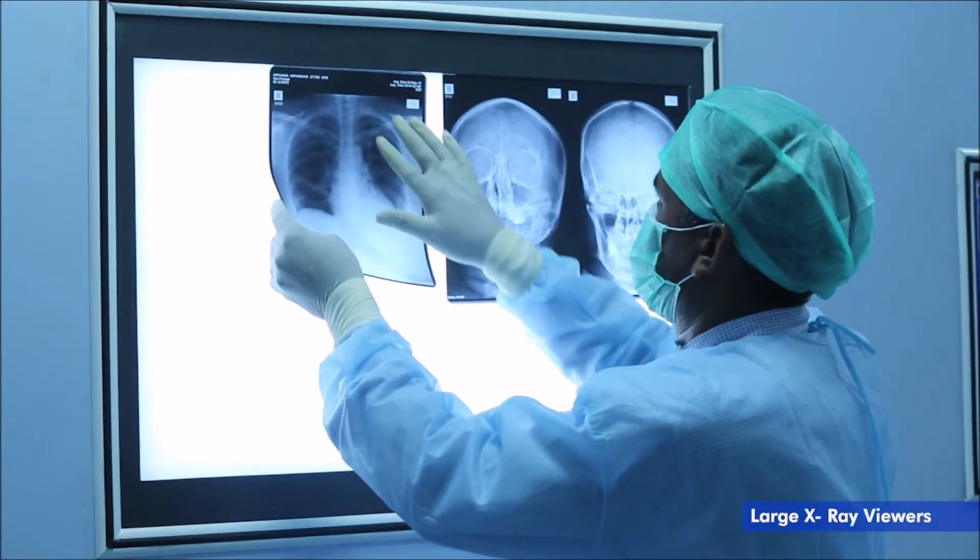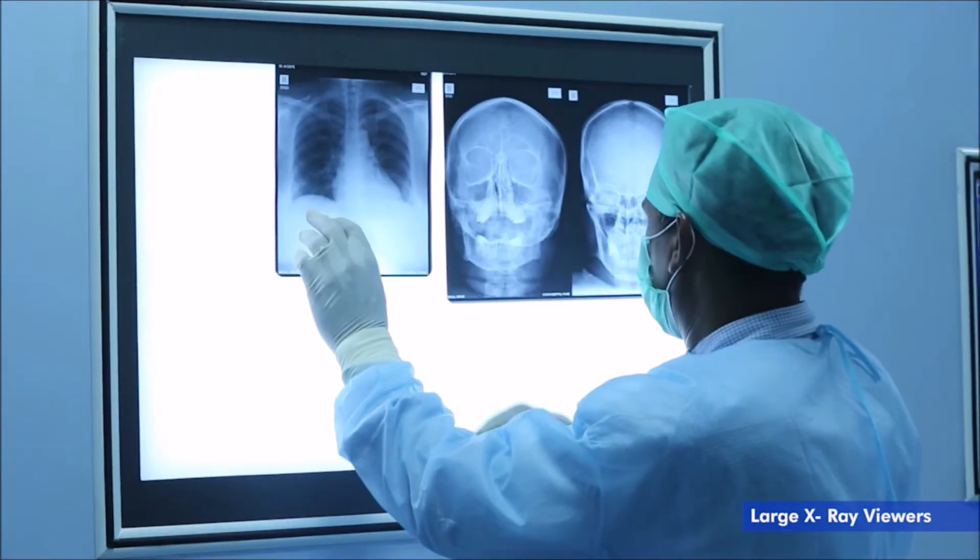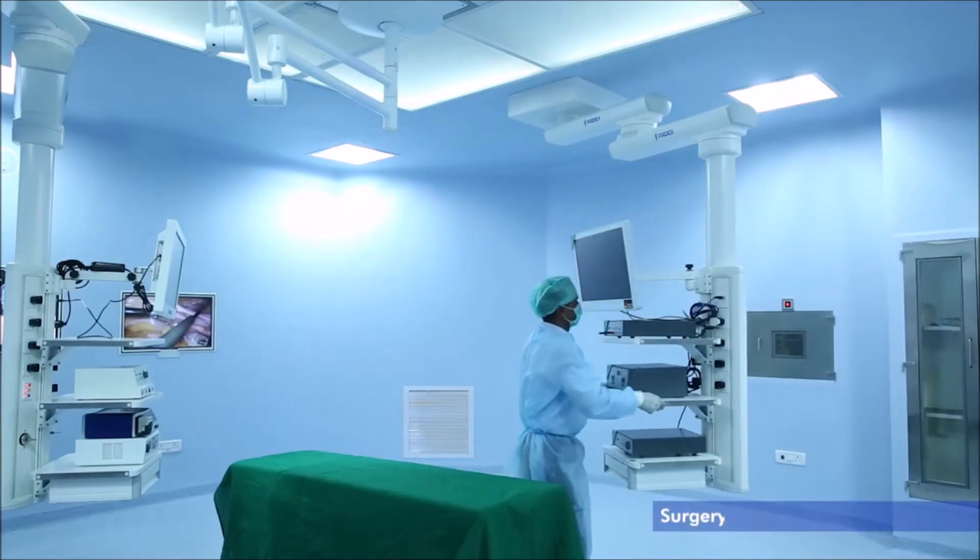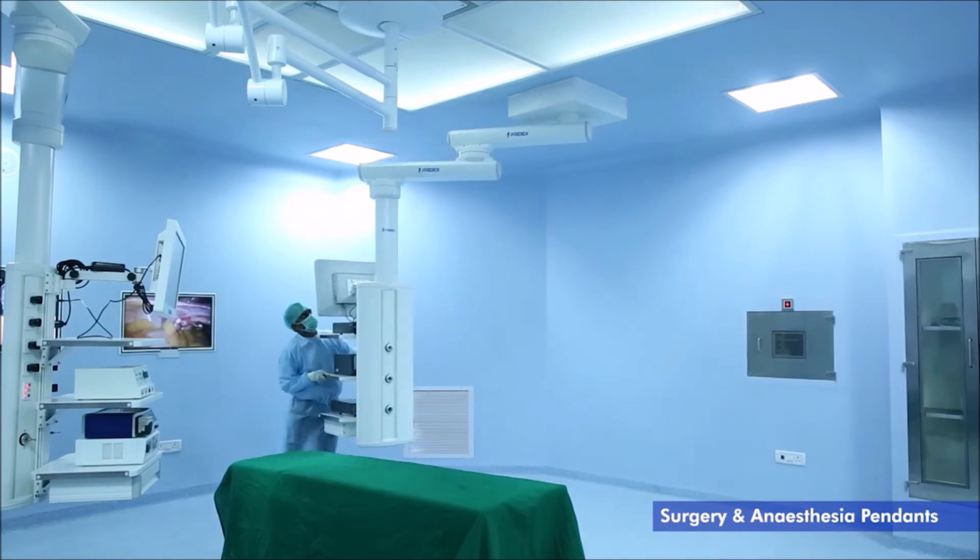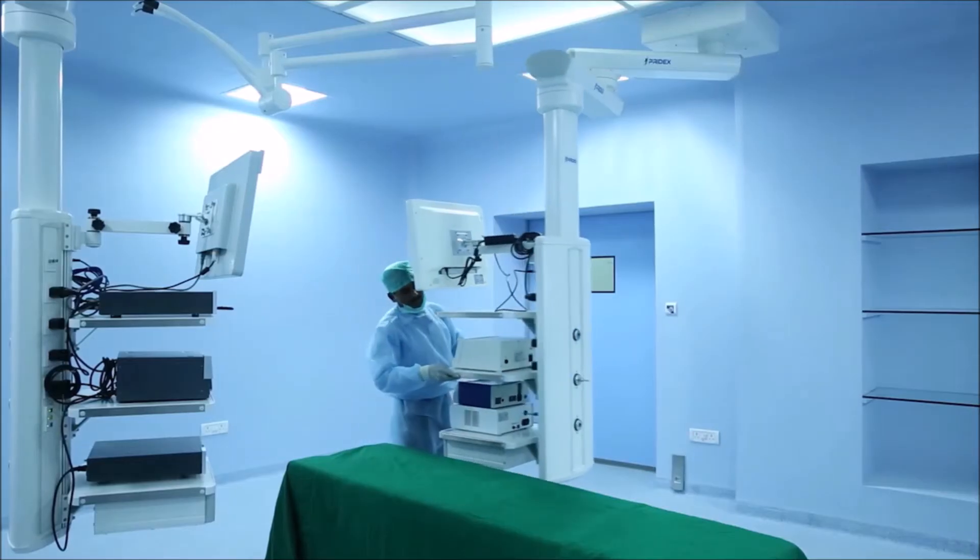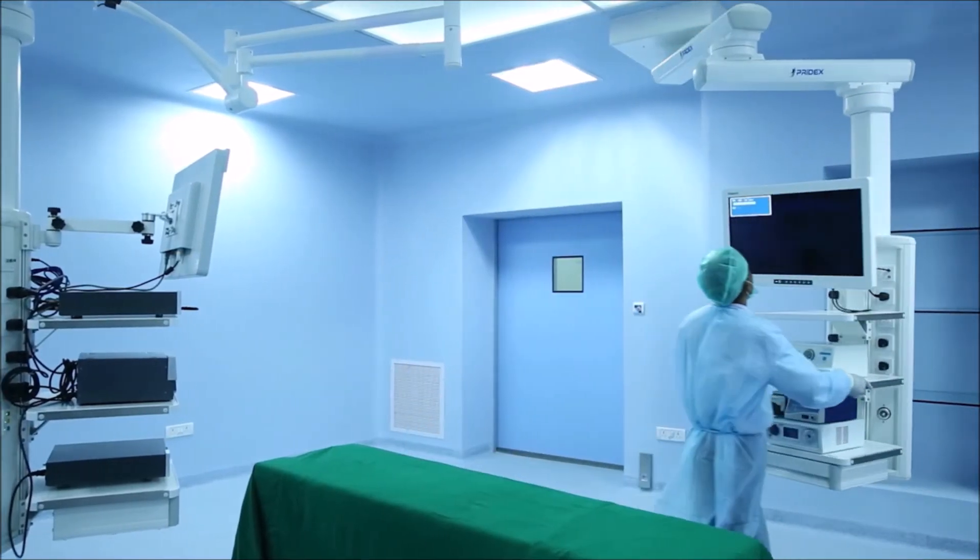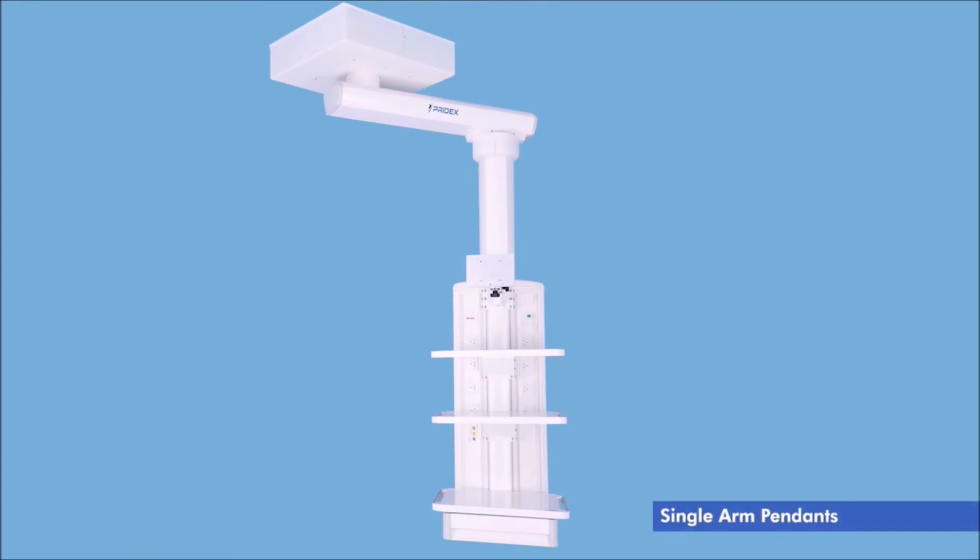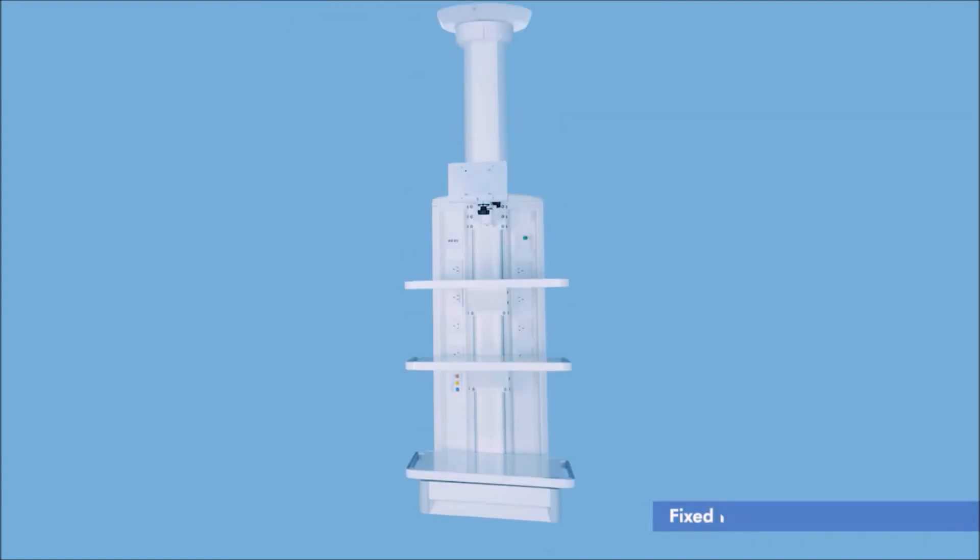Large x-ray viewers with adjustable intensity. Wide range of pendants: surgery and anesthesia pendants equipped with all necessary world-class equipments. Pendant can be supplied with double arm, single arm, or fixed.